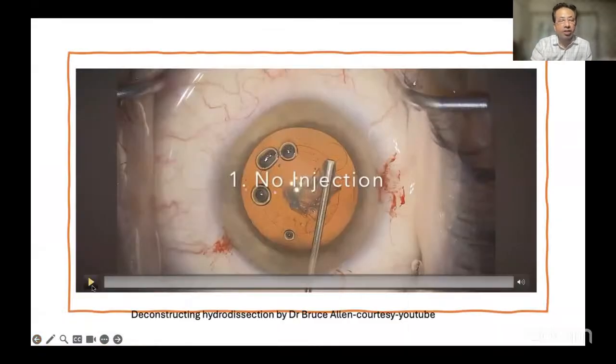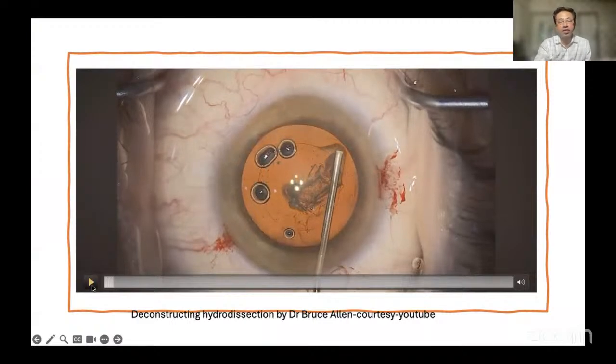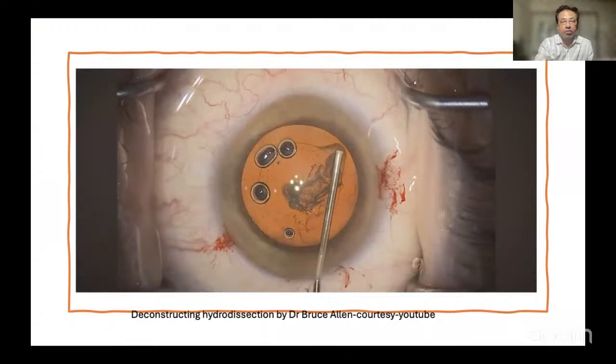Okay, just pause here. Don't play. Just pause it here. Now, the most common mistake people make is in the position of the cannula.